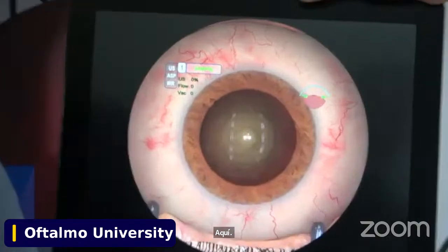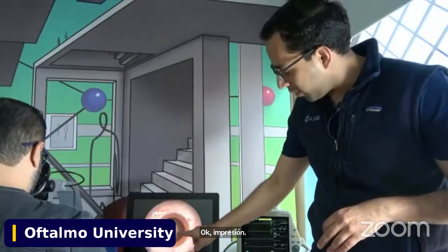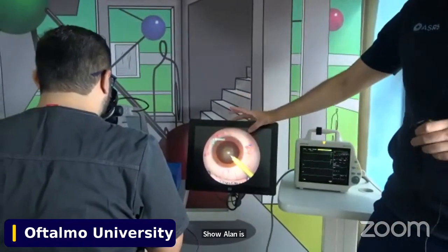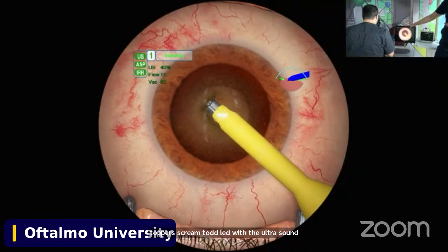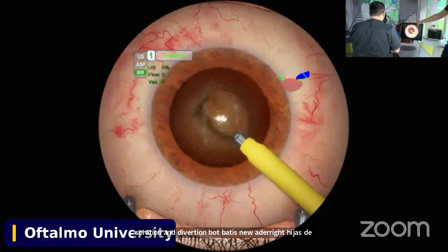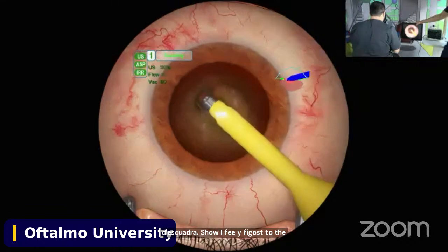Okay. So look, interesting, we have already the case. We have a hard cataract, as you see, it's kind of brown. He has a small rhexis. I don't know if you can see it correctly, but it's more or less here. So Alan is going to start. At the top of the screen, to the left, we have the ultrasound, the aspiration, and the irrigation. But what is new, at the right, is the exact point where the phaco handpiece is doing the sculpt. So if he goes too deep, he's going to break the posterior capsule, and he can notice where he's doing the task.